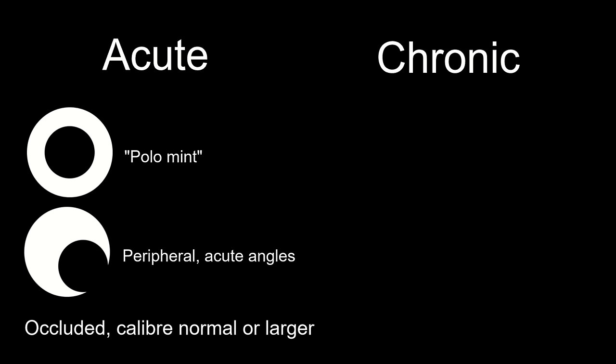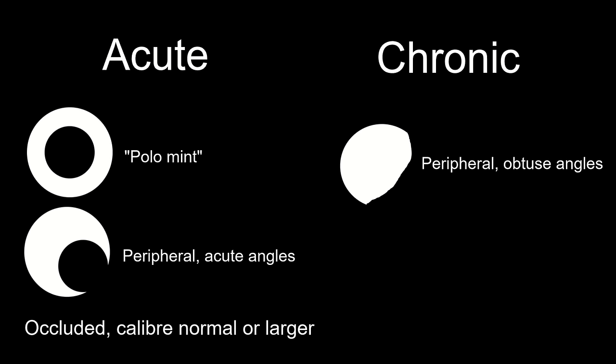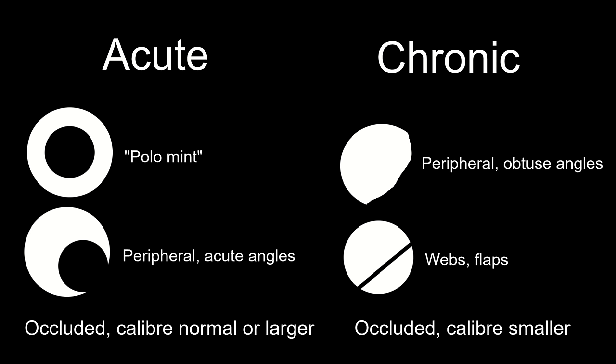In chronic PE, filling defects tend to be more peripheral and specifically when peripheral, they form an obtuse angle with the vessel wall. If they completely occlude the PA branch, the proximal vessel size is often smaller than adjacent vessels. You may also see webs or flaps, which are very linear in appearance. Additional findings of CTEPH — chronic thromboembolic pulmonary hypertension — are covered in our course.